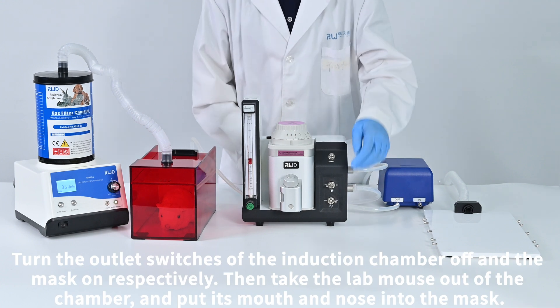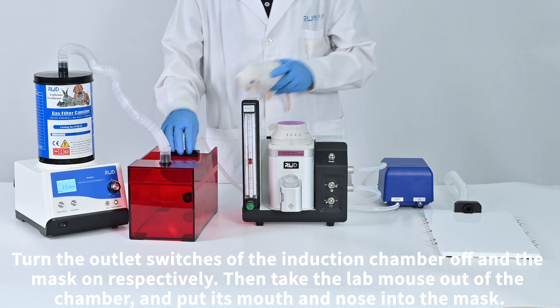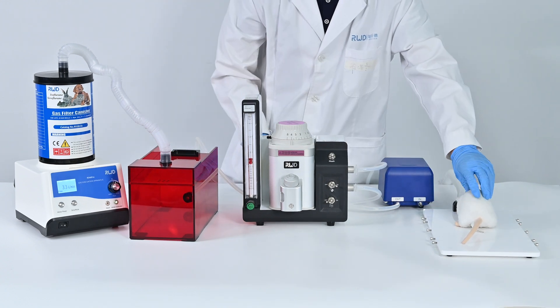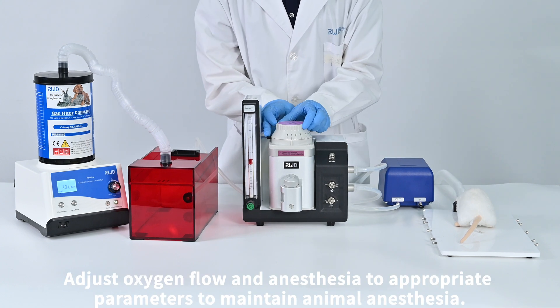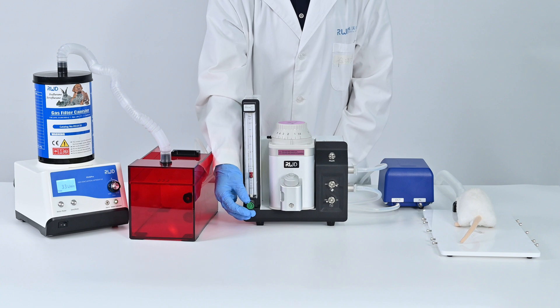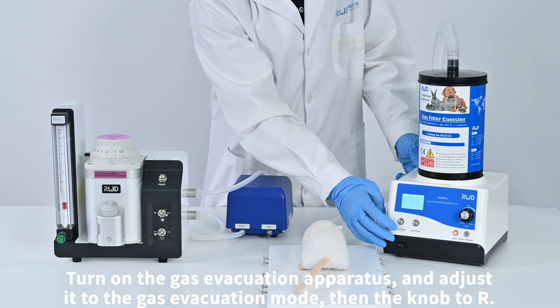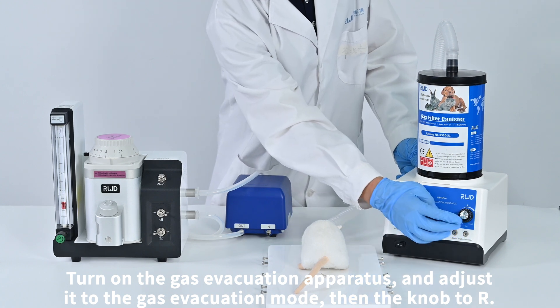Turn the outlet switch of the induction chamber off and the mask on respectively, then take the lab mouse out of the chamber and place its mouth and nose into the mask. Adjust oxygen flow and anesthesia to appropriate parameters to maintain animal anesthesia. Turn on the gas evacuation apparatus and adjust it to the gas evacuation mode, then set to R.